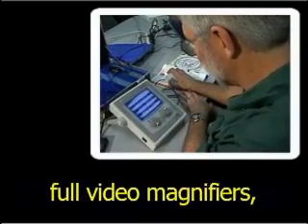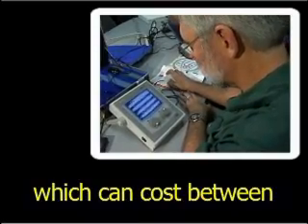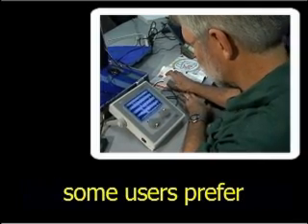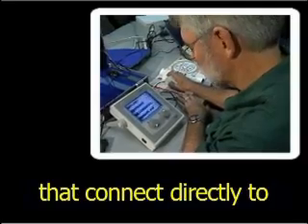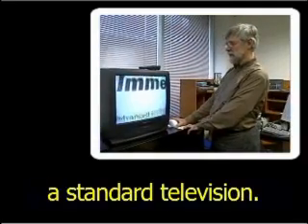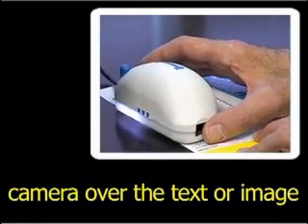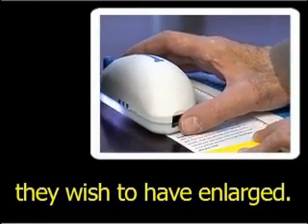Due to the expense of full video magnifiers, which can cost between $2,000 and $3,500, some users prefer less expensive systems that connect directly to a standard television. With these systems, users move a handheld camera over the text or image they wish to have enlarged.